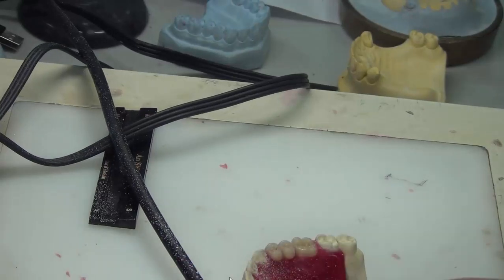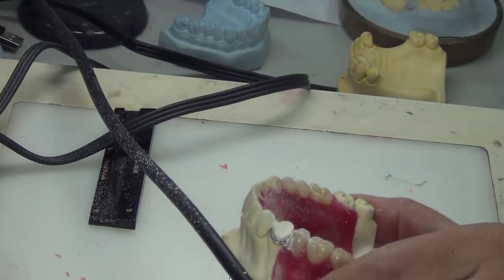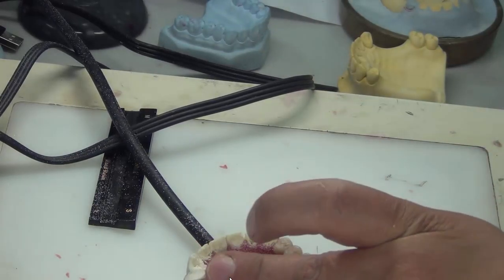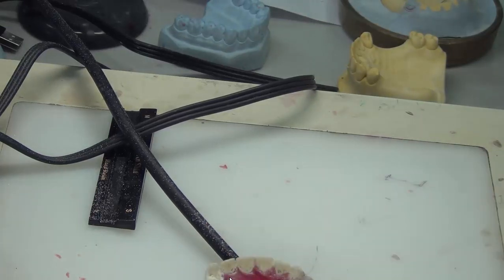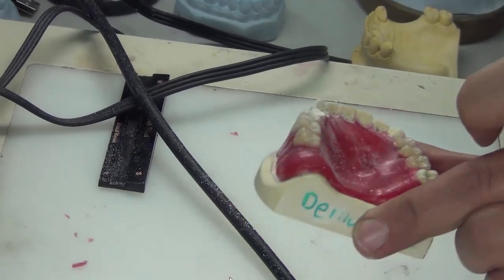I began with the abutment to show you that I have not touched the wire in the procedure. I have not touched the wire. I also have not touched the wax lingually. So the wax morphology lingually is kept, okay? I just removed undercuts. So I continue.